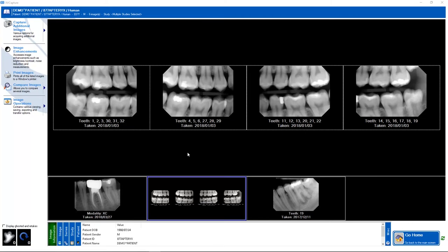In this tutorial, we will go over the steps needed to export images from XvCapture.